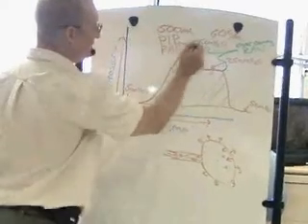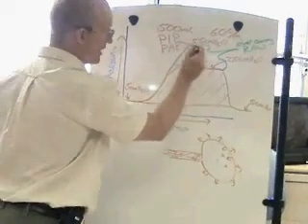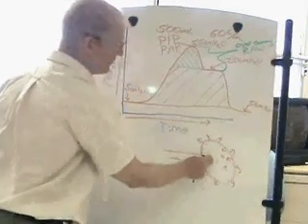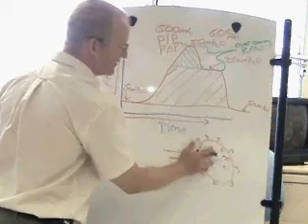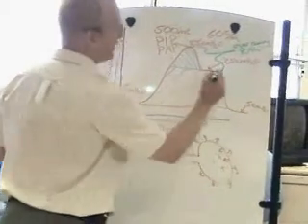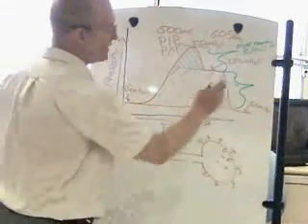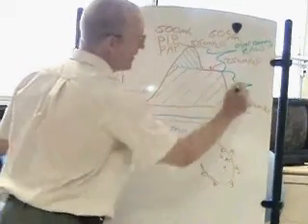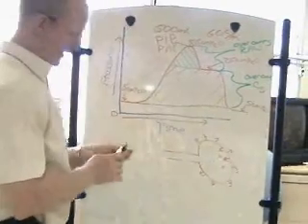So, from baseline to the peak inspiratory pressure, we had both of these things occurring. Once we got to the peak inspiratory pressure and we held the breath, we removed all of the flow, and the only pressure that we have left coming back from my patient is pressure due to the patient's compliance. Okay? Since this compliance is measured under no gas flow, this is called static compliance. So when we look at this graph and ask why is that pressure gradient there, it's because that pressure is required to push this volume in against this patient's static compliance. Or it's the pressure used to overcome static compliance, abbreviated big C, little s.